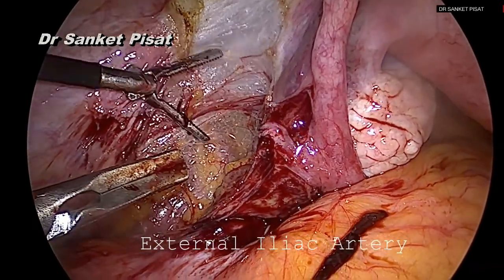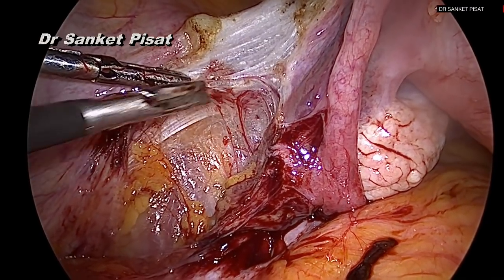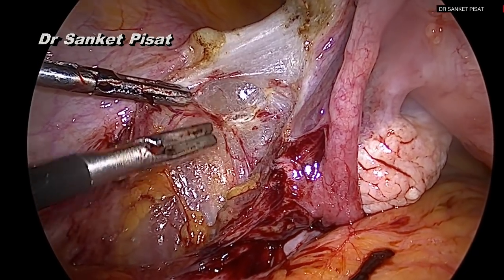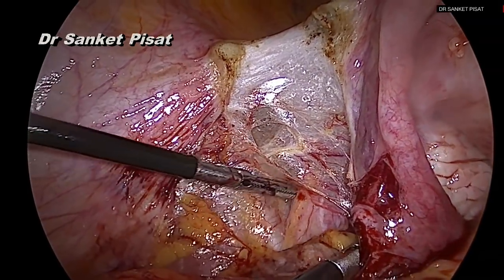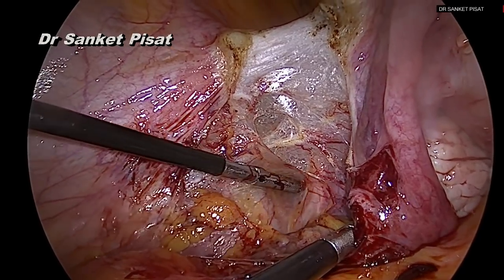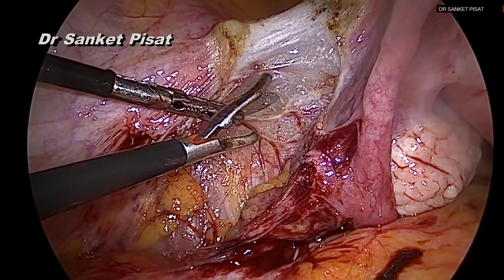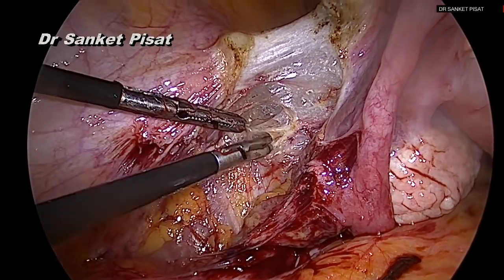Once this structure has been identified, more transverse fibers can be safely divided at this level, combining sharp dissection along with blunt dissection using the bipolar cautery or preferably a harmonic scalpel, so as to separate the anterior and posterior leaves of the broad ligament from each other. Once more dissection has been performed and the transverse fibers cut, a structure starts becoming apparent on the medial leaf of the broad ligament, which is the ureter.